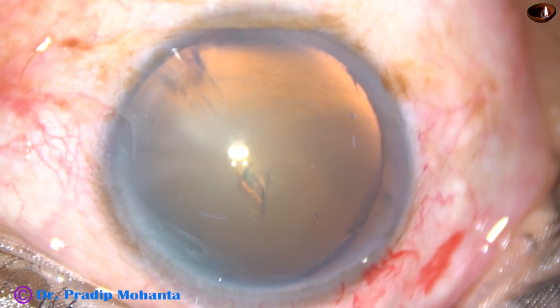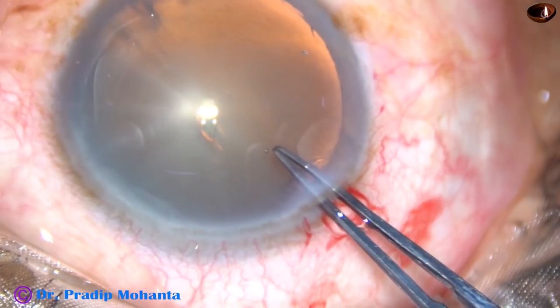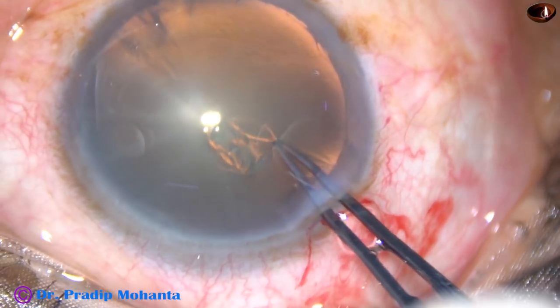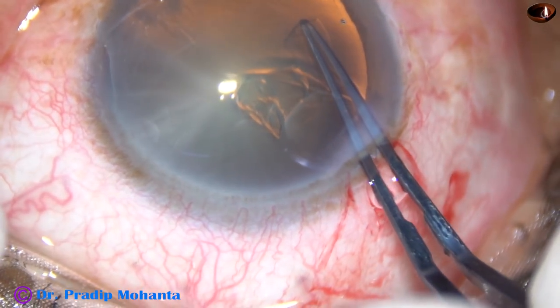Now I take a utrata forceps, lift the anterior lip of the main incision so that leakage of viscoelastic substance is minimal, and go anti-clockwise all around to do the rhexis.